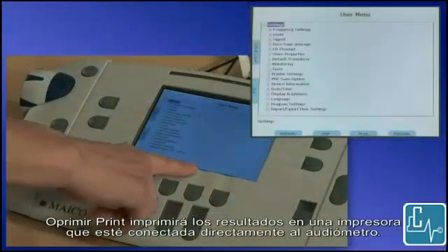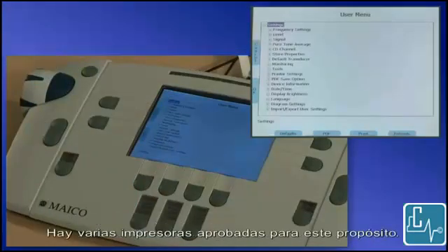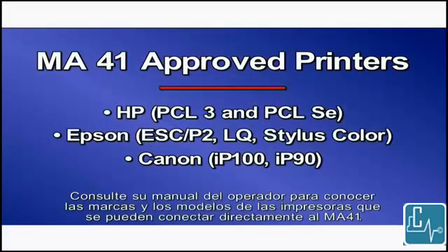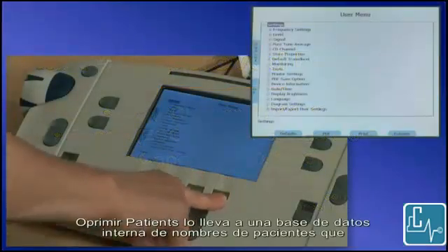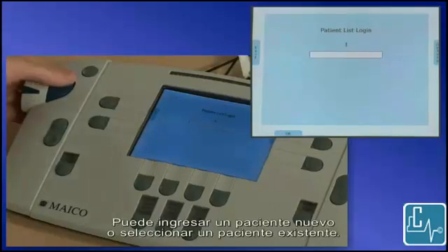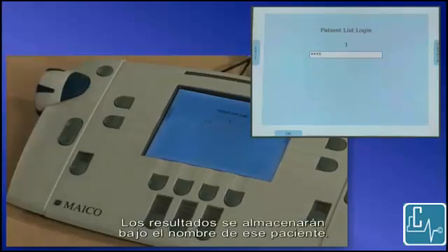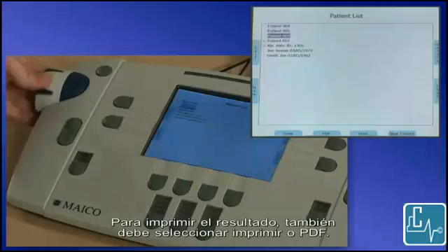Pressing print will print the results to a printer that is connected directly to the audiometer. There are several printers approved for this purpose. Please refer to your operator's manual for make and model of printers that may connect directly to the MA41. Pressing patients takes you to an internal database of patient names that is stored on the SD card. Enter your PIN to access the database. You can enter a new patient or select an existing patient. The results will be stored under this patient's name. In order to print the result, you must then also select print or PDF.